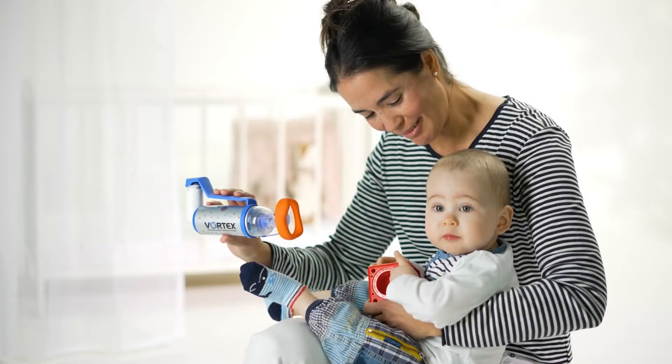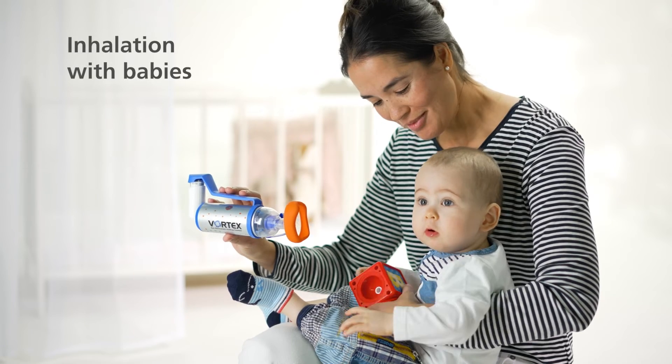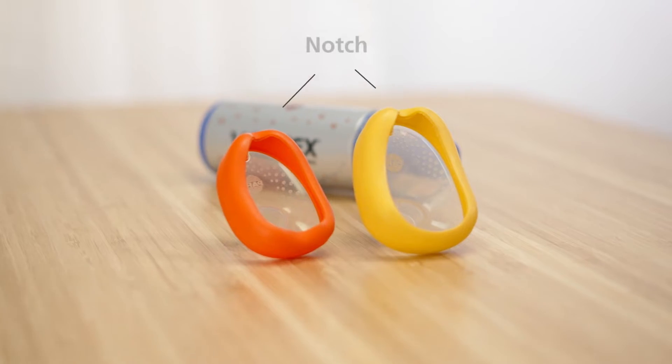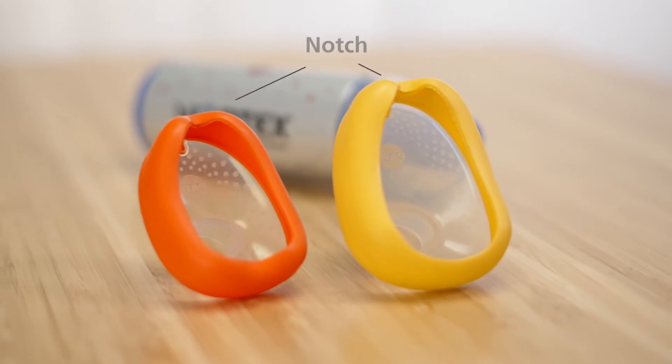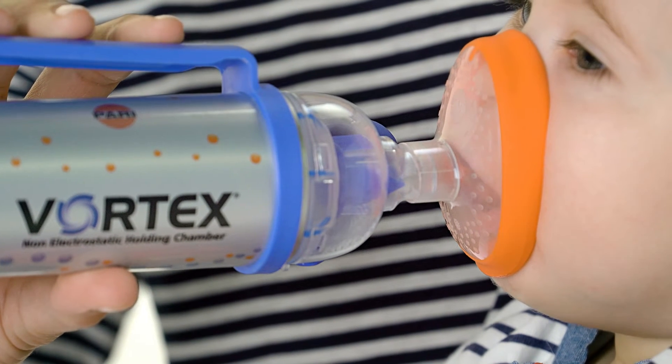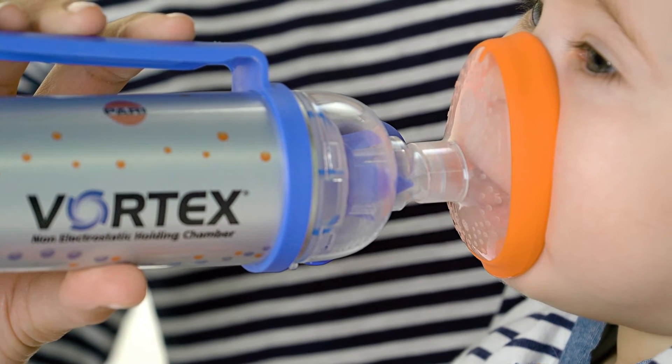After you and your baby have become familiar with the Vortex, gently place the Vortex mask on your baby's face. Make sure that the hole for the nose is facing upwards.